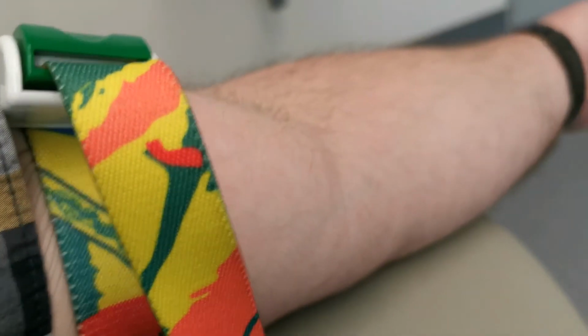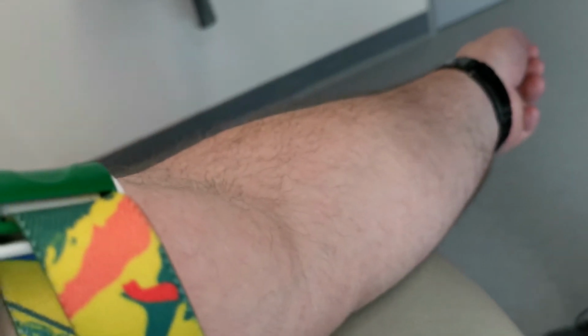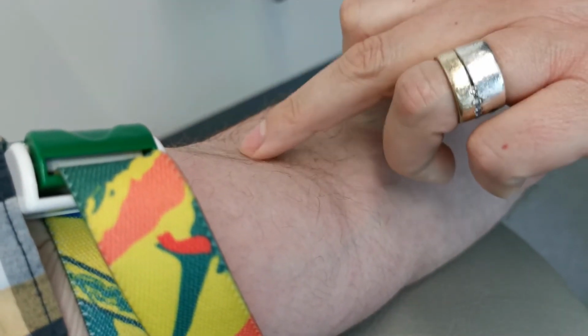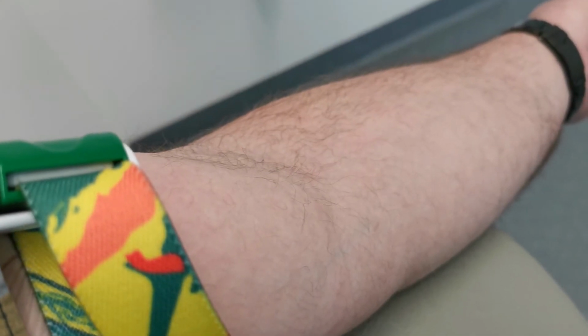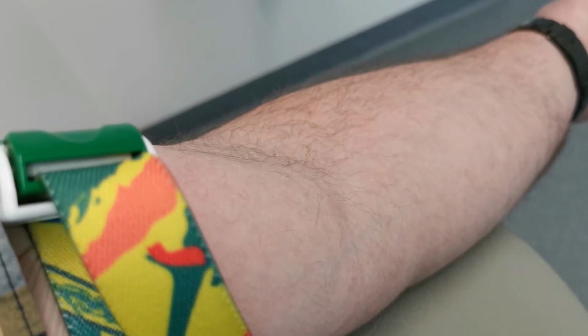Right, so here I am at the pathology lab. The pathologist is going to draw some blood to have it tested. Now, what she's doing right now is actually rubbing a little swab of alcohol on my arm. That makes the arm feel nice and cool as the alcohol evaporates.